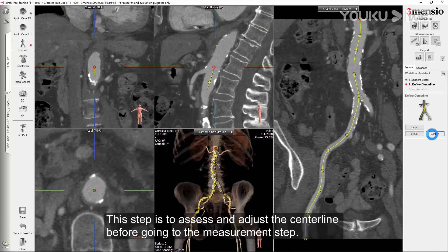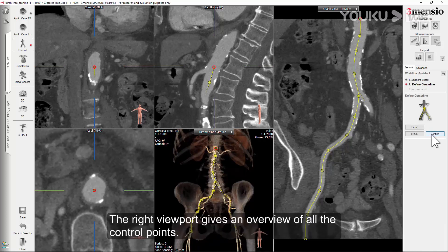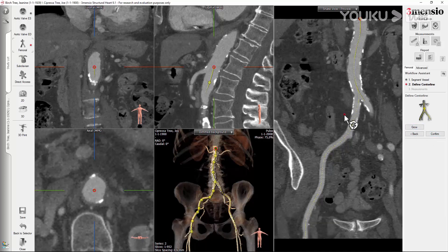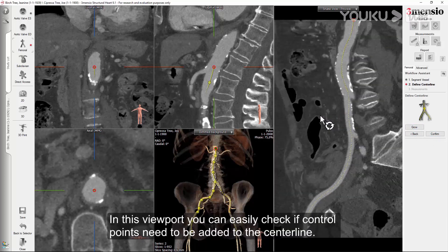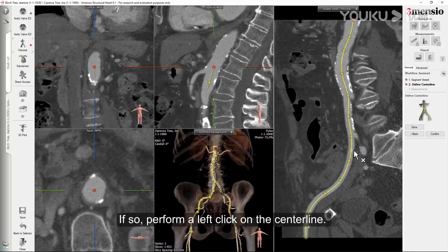This step is to assess and adjust the centerline before going to the measurement step. The right viewport gives an overview of all the control points. In this viewport, you can easily check if control points need to be added to the centerline. If so, perform a left click on the centerline.